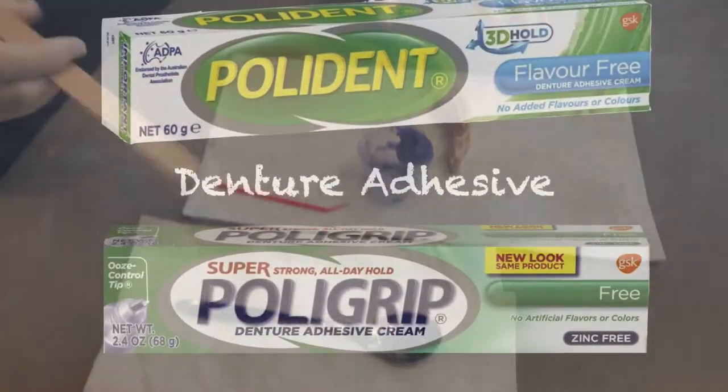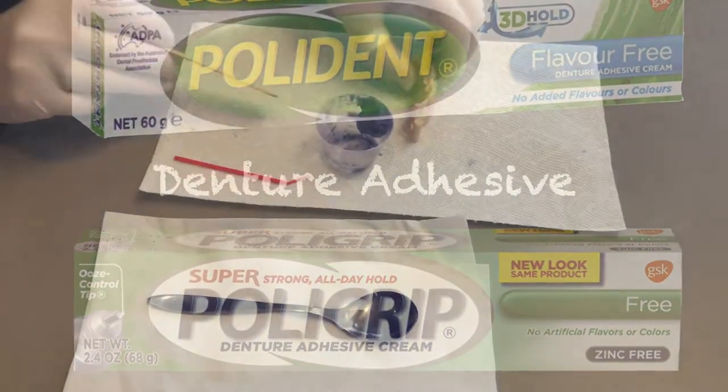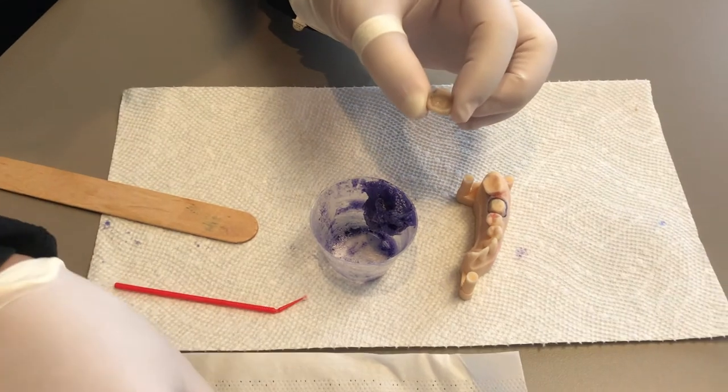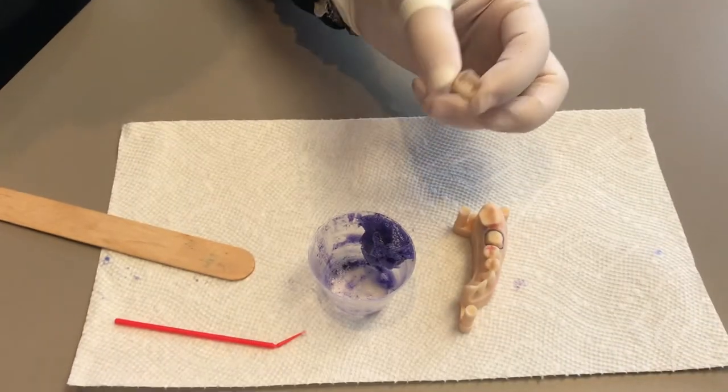What you want to do is buy some Polident or Polygrip in a drugstore, and if your crown has come out of your tooth, you want to just put a little bit of Polident. Make sure that you dry your crown and your tooth really well with even Kleenex or gauze.